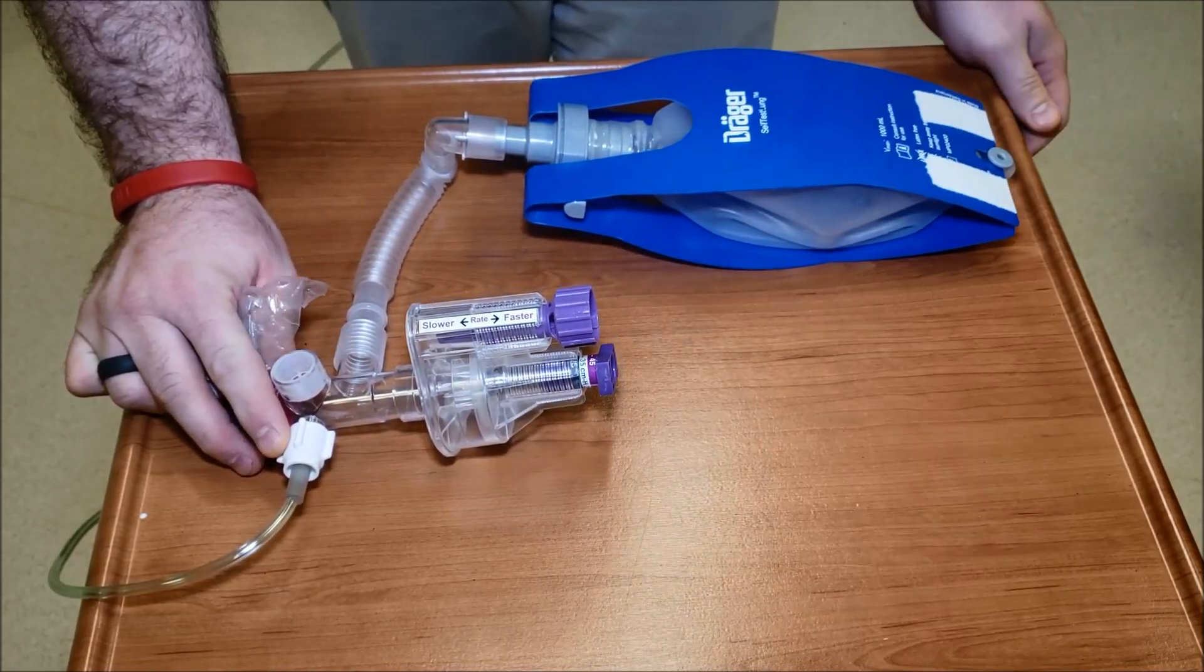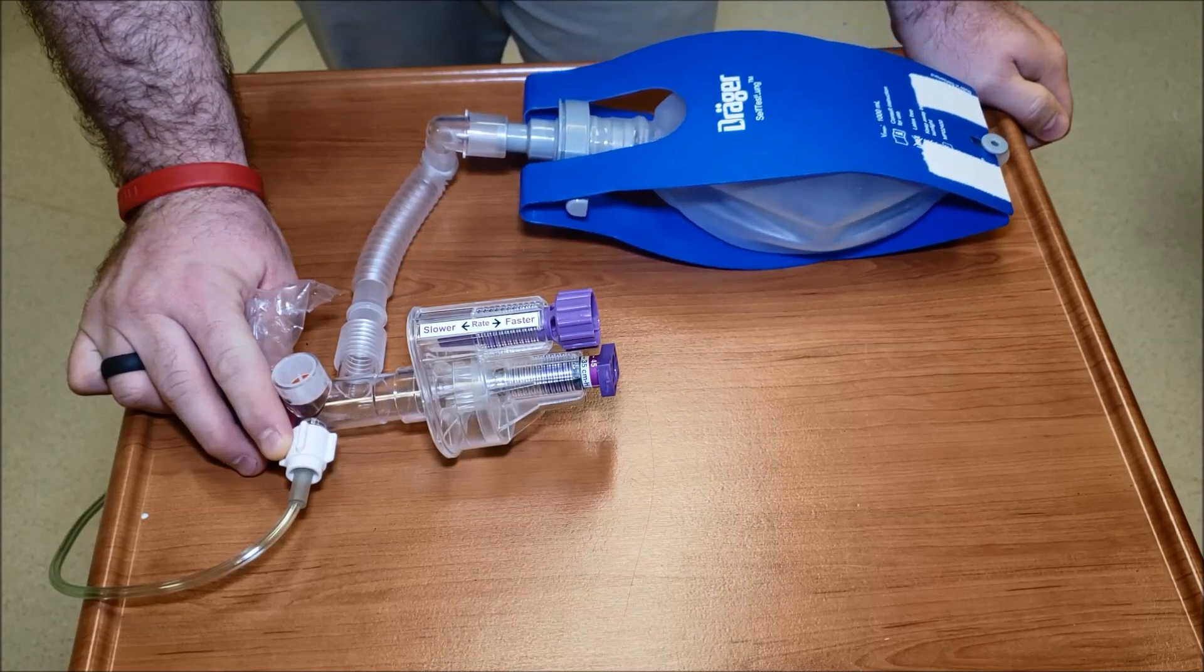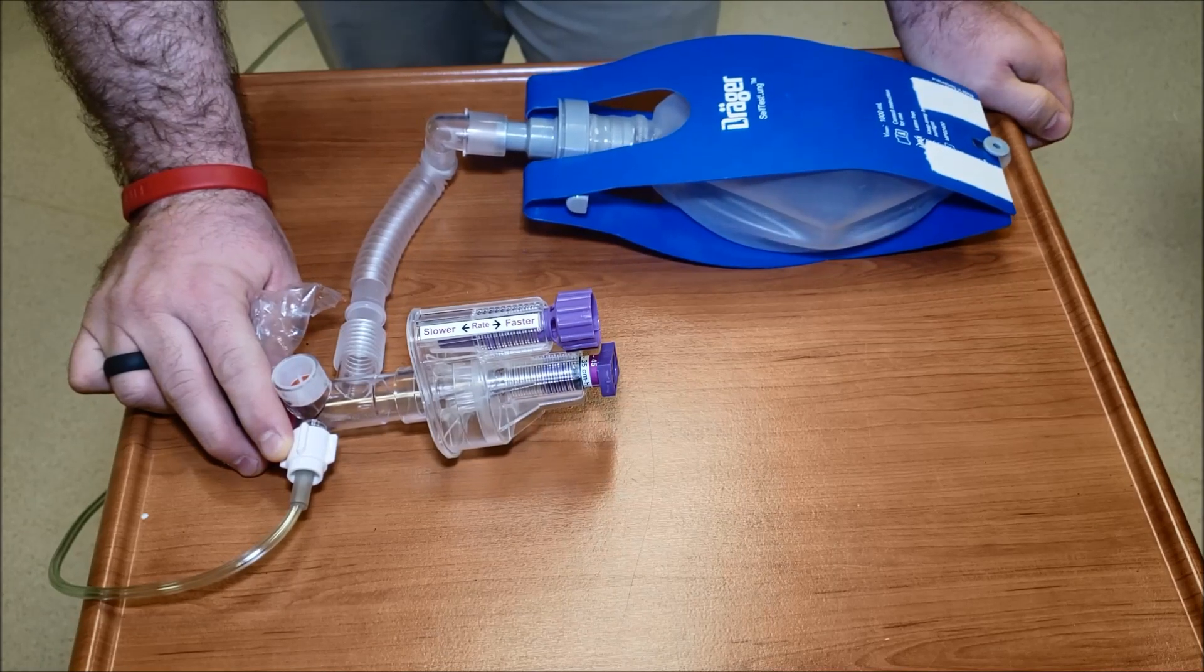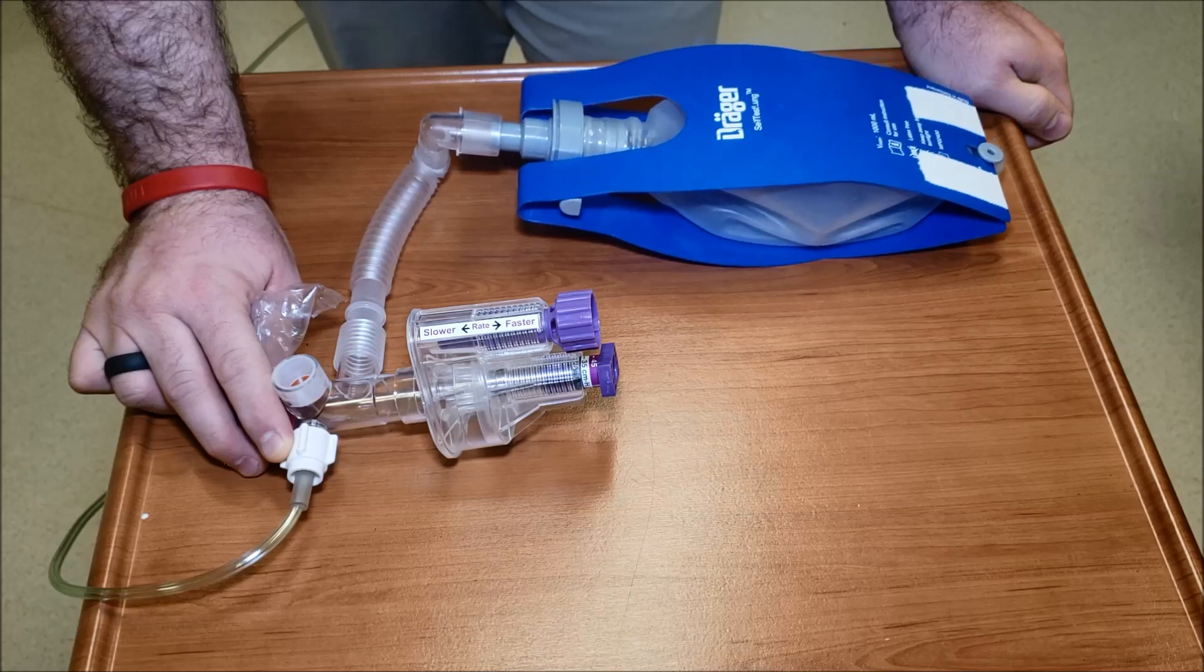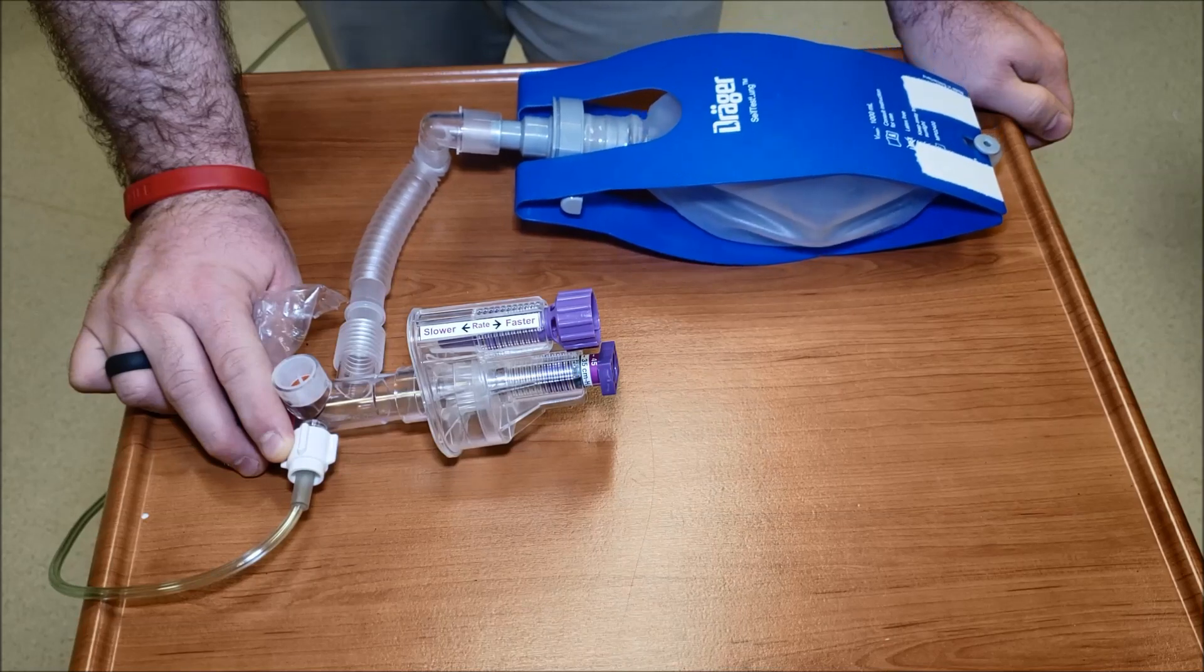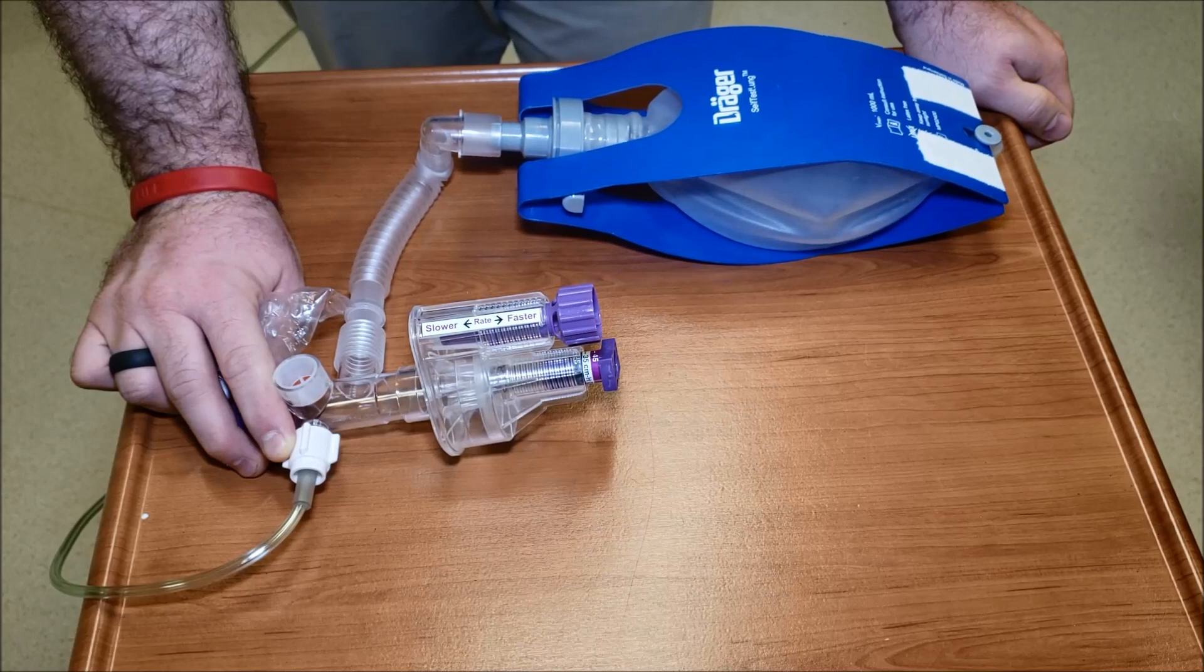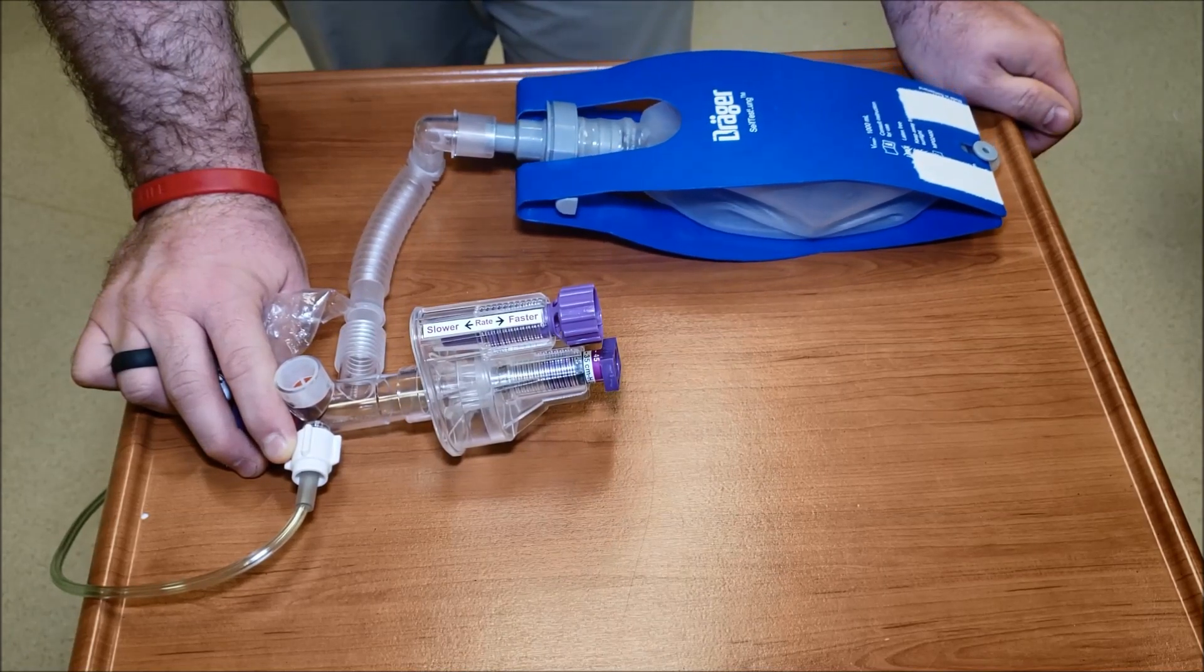Let me see, do a breath: one one thousand, two one thousand, three one thousand, four one thousand, five one thousand, six one thousand. So about every six seconds, ten breaths per minute. And that's really good. I really like that rate. It's good for any kind of ventilation you have going on.